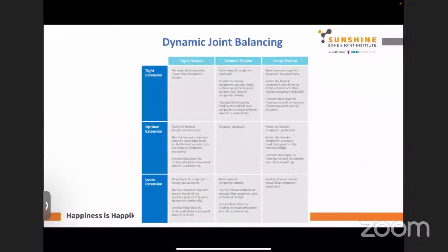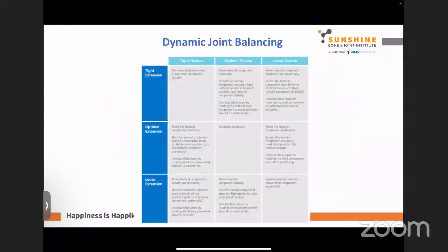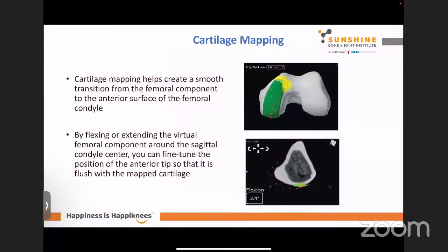So how do you do that? You have this big table, something called functional positioning of the implants. I'm not going to go too much into that. But if you go here, just by anteriorizing my femoral component, I can increase my flexion gap. Just by making my tibial component a little less proud, I can increase all my flexion and extension. So there's a lot of playing around that you can do. You can just take a screenshot of this if you want.